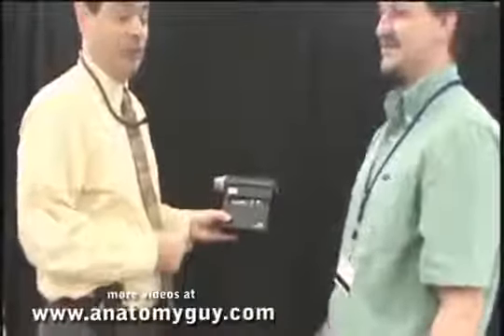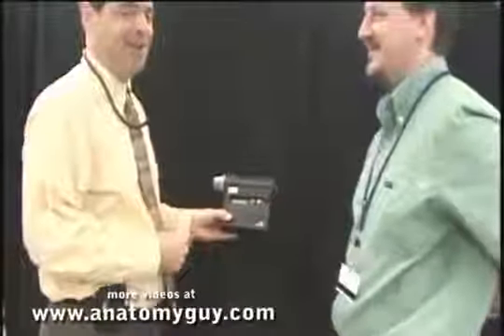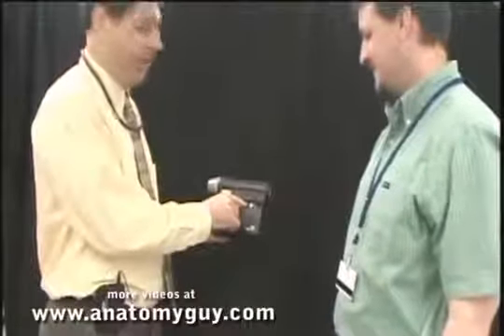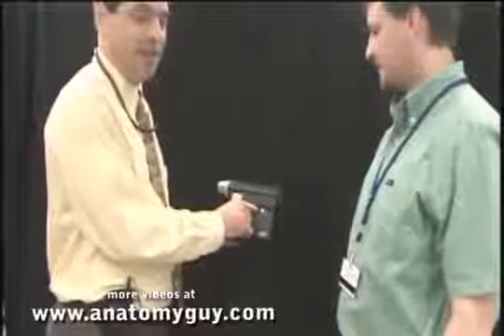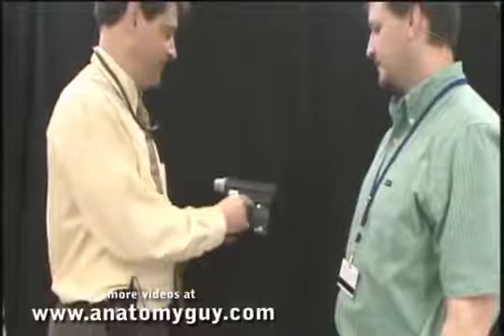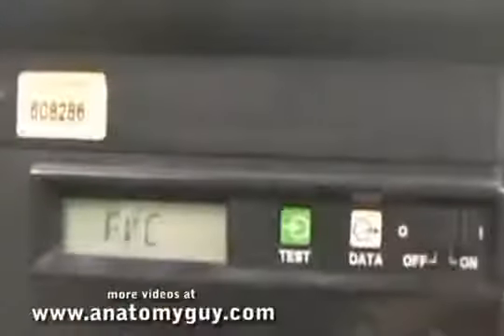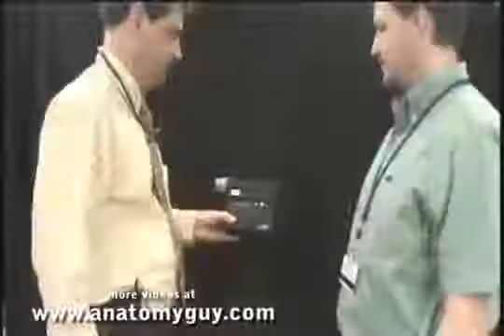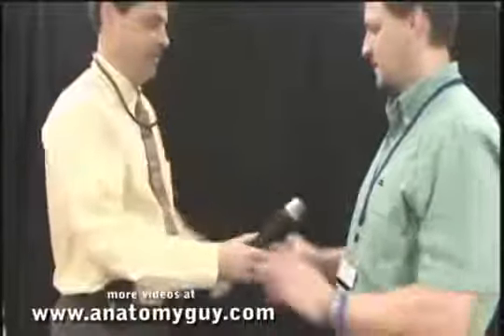Now, unfortunately, very competitive. Since this is an effort dependent test, to get a good result, you need to get the best of 3. So you got to do it again. So we hit select again, FVC, steady. Do it again. Keep going, keep going, keep going.